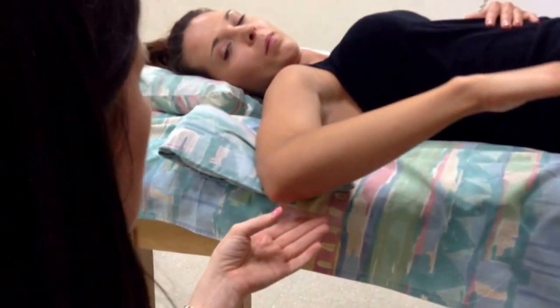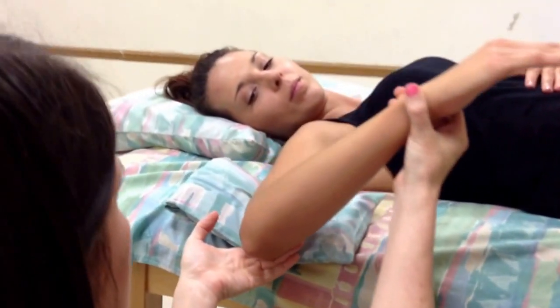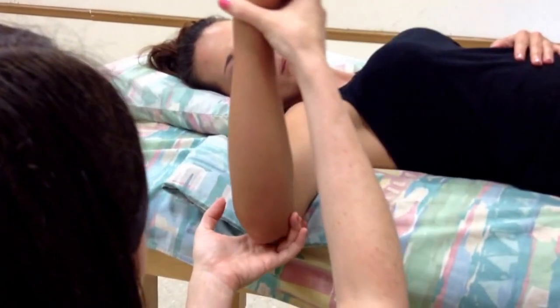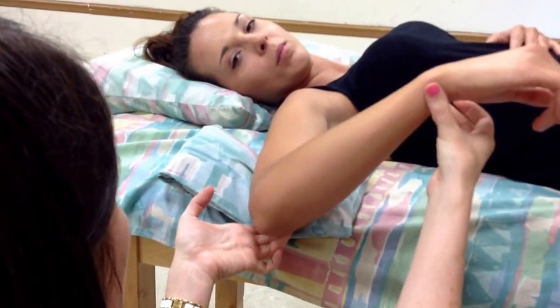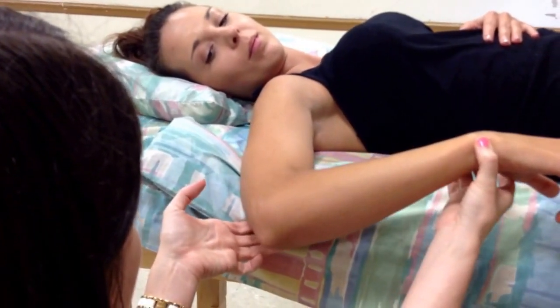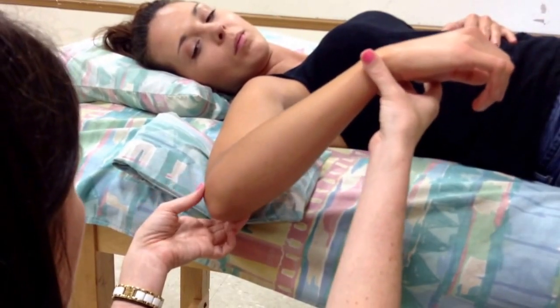We're going to bring her hand forward as far as she can. There's a little bit of compensation happening here — you can see the humeral head kind of popping up anteriorly. So let's bring your hand forward. See how much it really starts to pop up there? We're going to stop her right here because that's when it really starts to jump up.